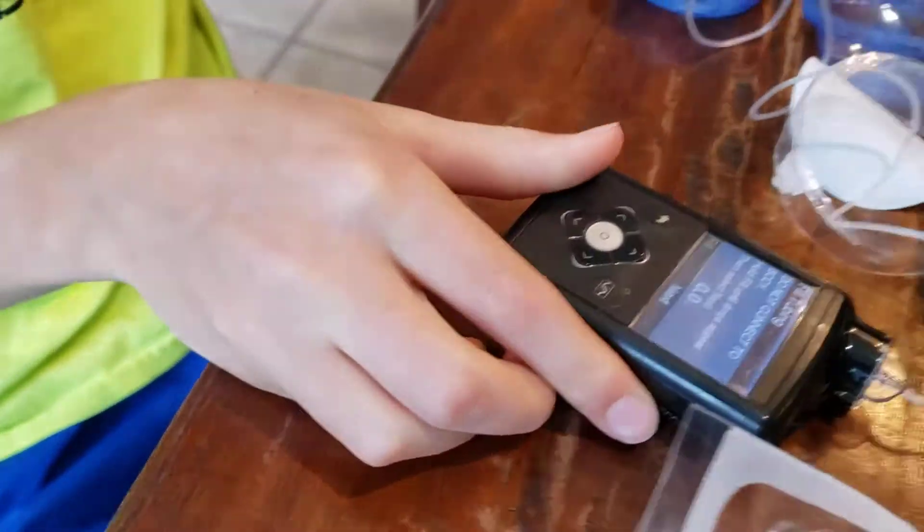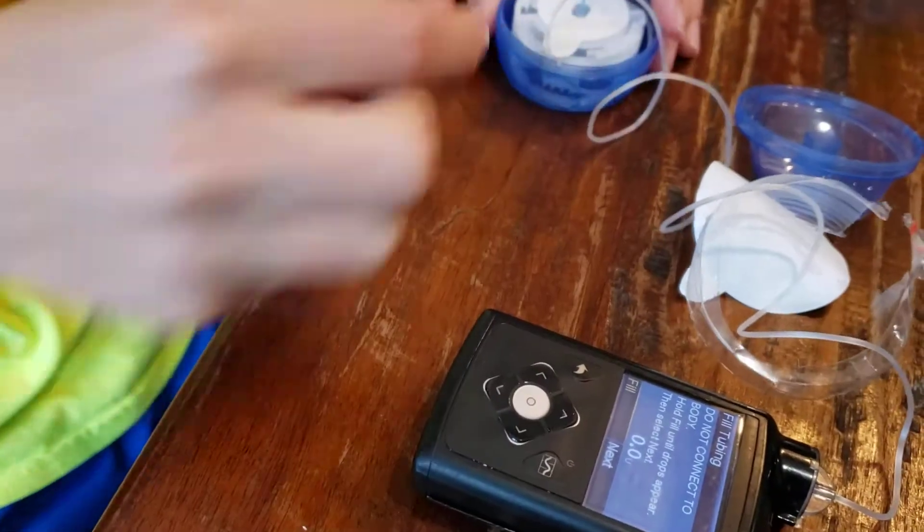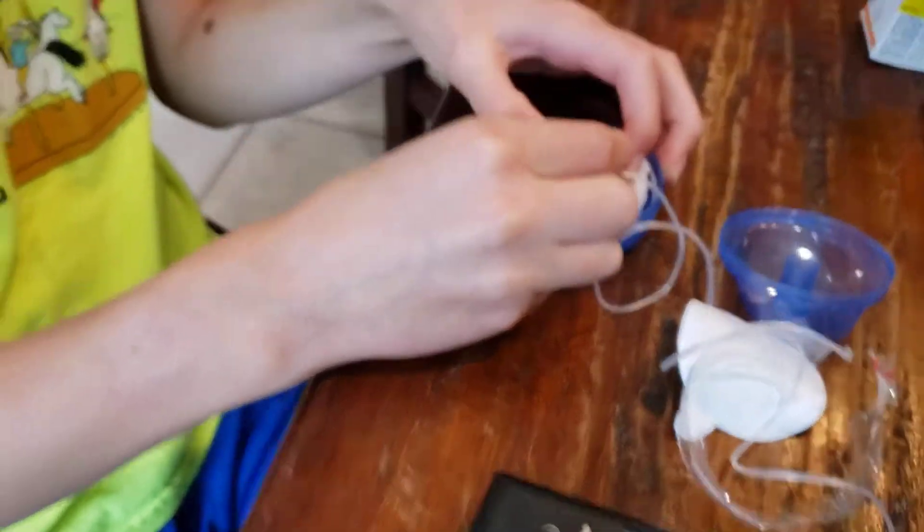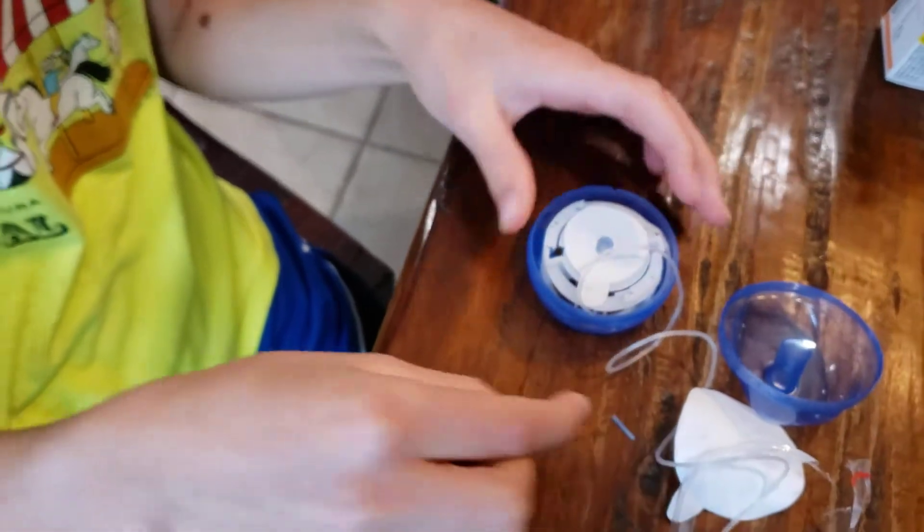Now you have to hold it. So you have to take out the fill. You have to take a napkin or something. But first you have to take out this little blue thing off the needle.